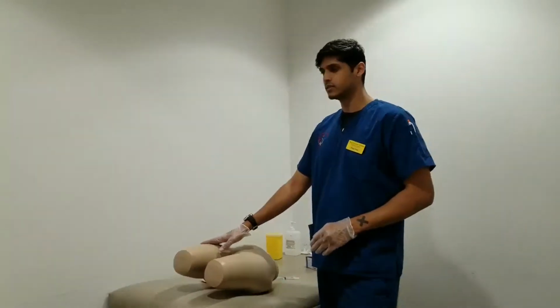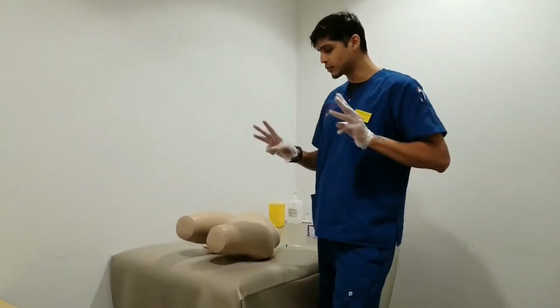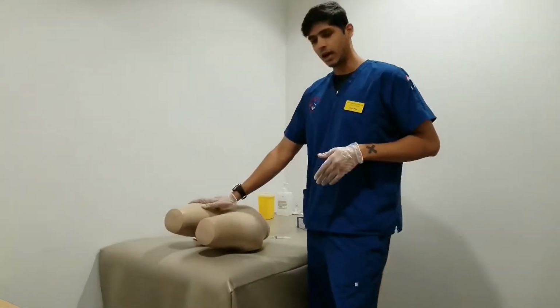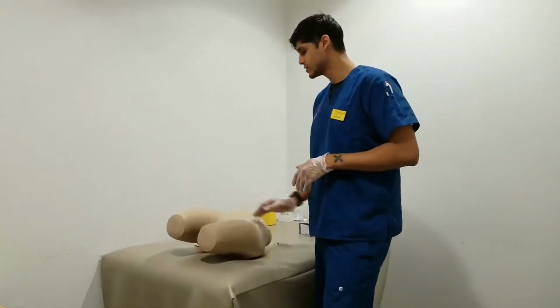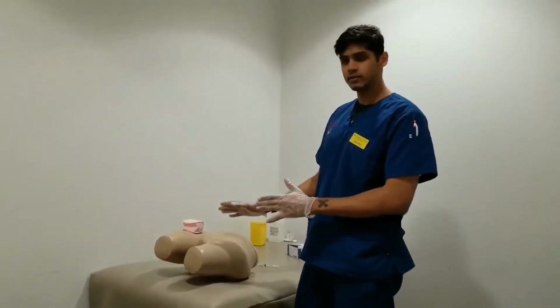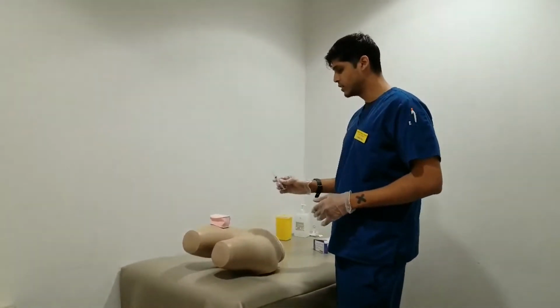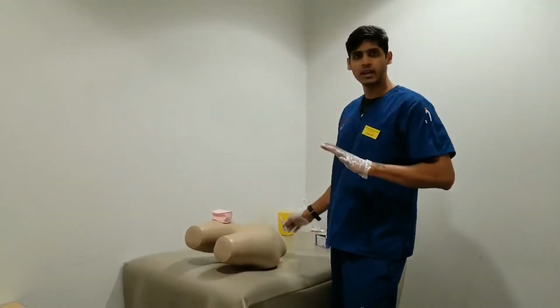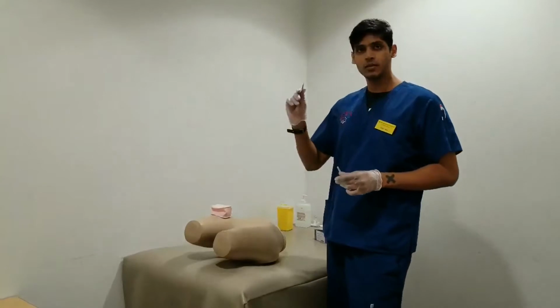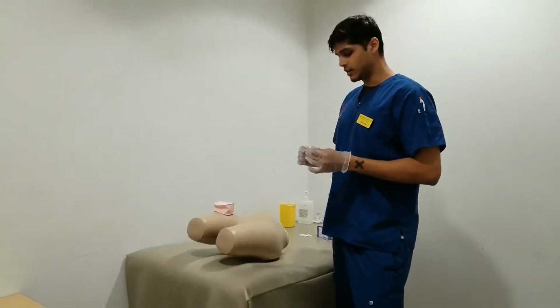Another site is the gluteal and your deltoid as well. So those are 3 locations where you want to ideally perform intramuscular injections. I'm going to be doing it in vastus lateralis. So we have our site, we have our designated area ready, we have our medication. Just like subcutaneous, I'm going to be going in circular motion and using an alcohol swab, which I already did, and toss it up. I'm letting it air dry right now.